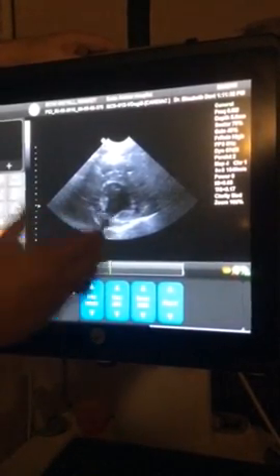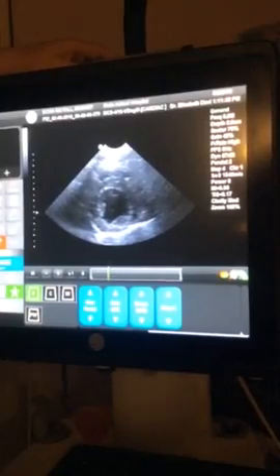So M mode is our gold standard. That's what we want you to try to do. I'm going to switch movies here.